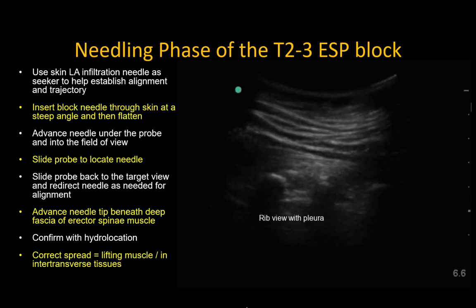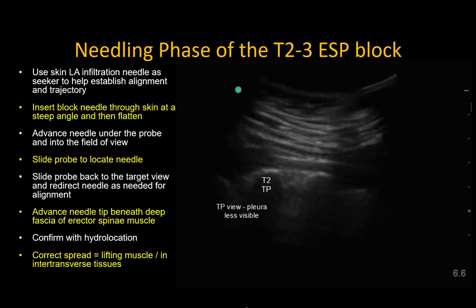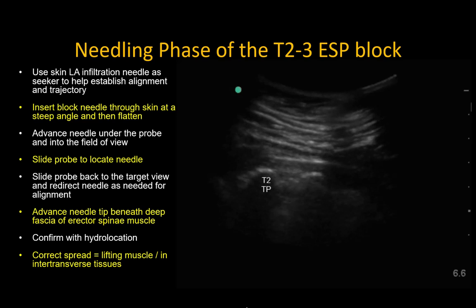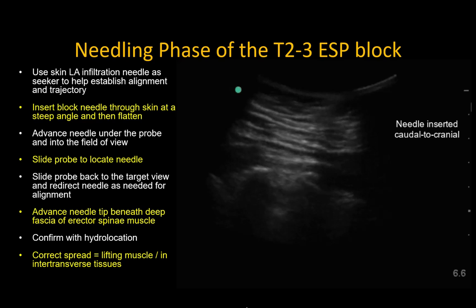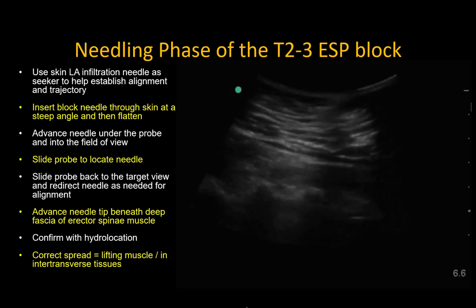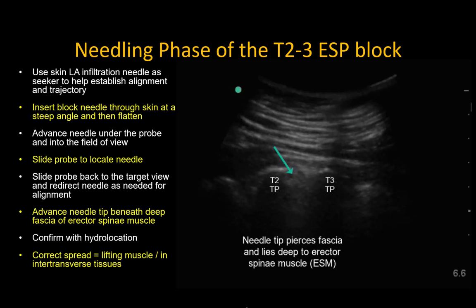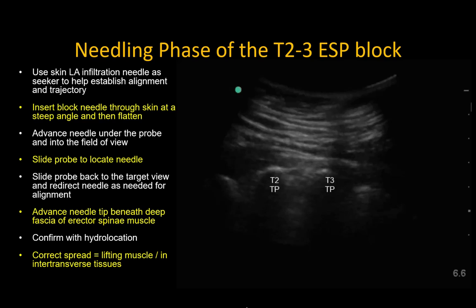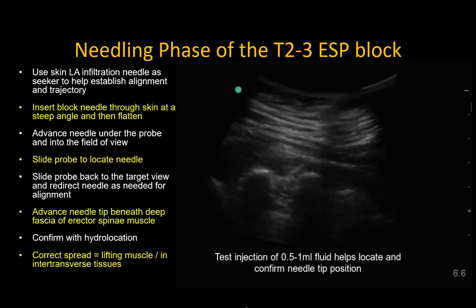This is an example using a curved probe in a larger patient. Again, we start by identifying the ribs and the pleura, and then move medially to obtain a transverse process view, in which the pleura is usually less visible. The needle is more difficult to visualize clearly in this instance, but it can be tracked by sliding micro-movements of the probe and tissue motion as the needle advances through the muscles. Aim to place the tip below the deep muscle fascia. Note how the T2 transverse process again acts as a backstop for safety. Perform test injections to ensure the injectate is spreading under the muscle and, most importantly, under its investing fascia. Dynamic scanning can help to confirm this.